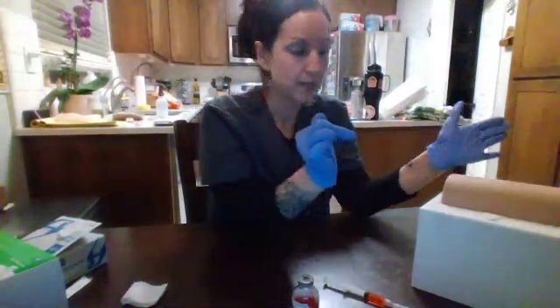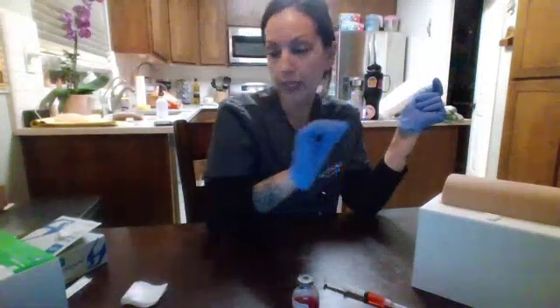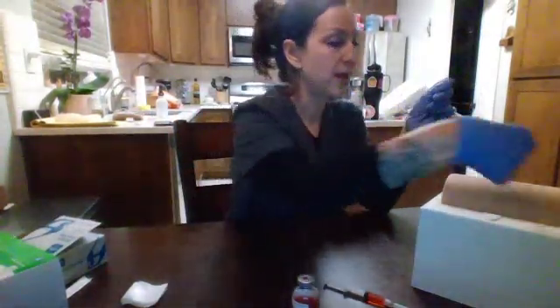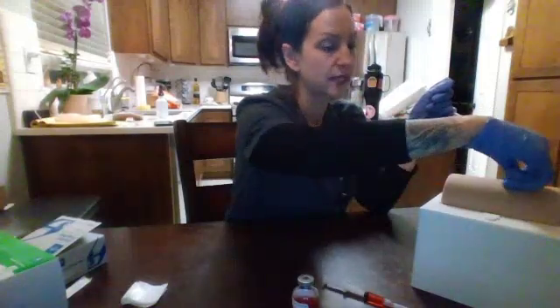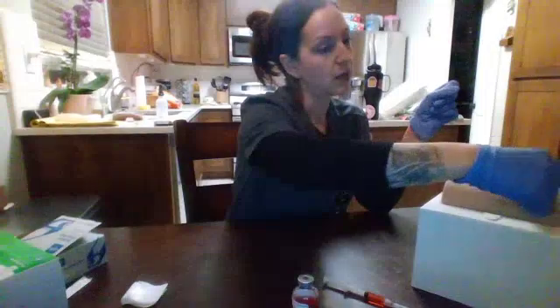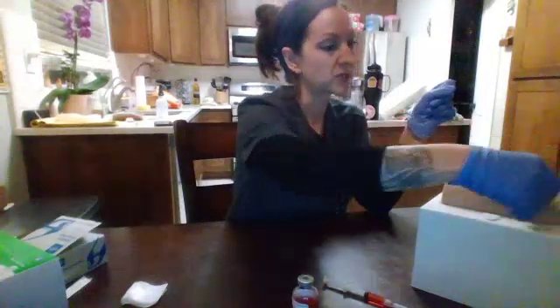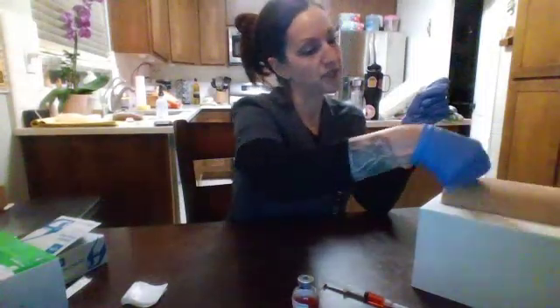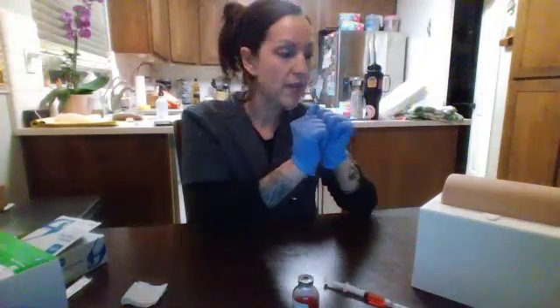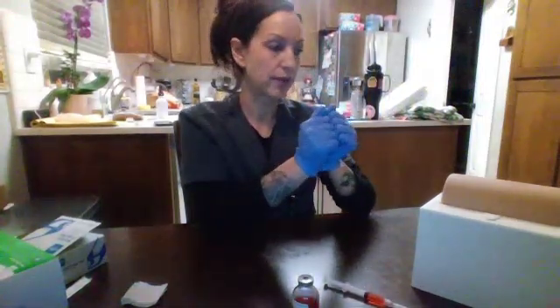Now that I've located that, I'm going to clean the area with another alcohol prep pad. I'm going to place the prep pad in the center of the selected injection site. And in an outward circular motion, I'm going to clean the area. It's roughly 5 centimeters or 2 inches. I'm going to allow that to dry completely. Do not touch or wave or blow on the area.